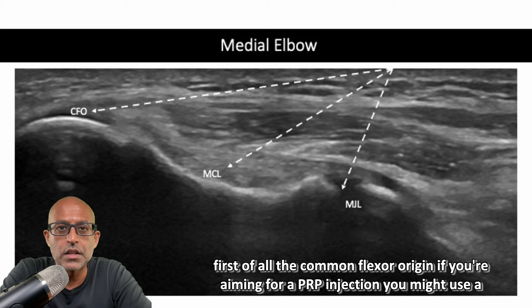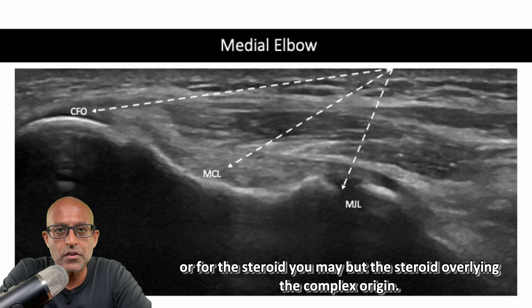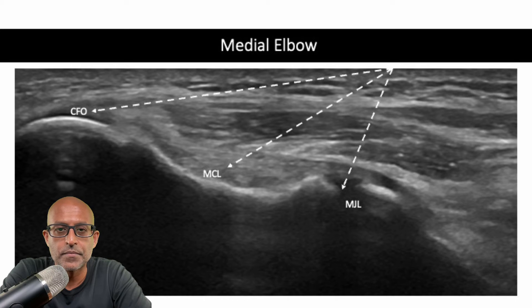First of all, the common flexor origin. If you're aiming for a PRP injection, you might use a fenestration technique. Or for the steroid, you may put the steroid overlying the common flexor origin.